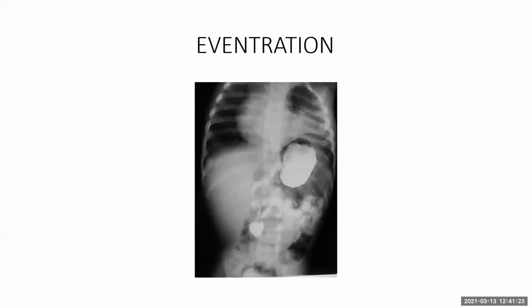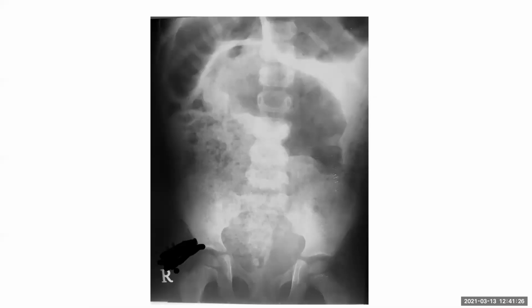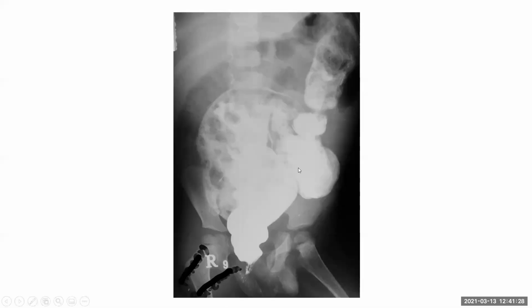Ma'am, one doubt. In the previous case, was there any other segment of narrowing in this one, in the descending colon? Yeah, there was one.